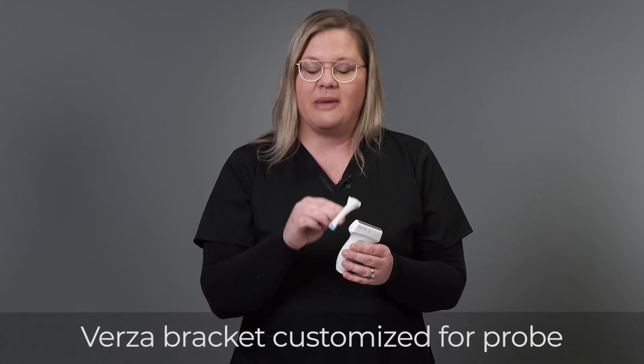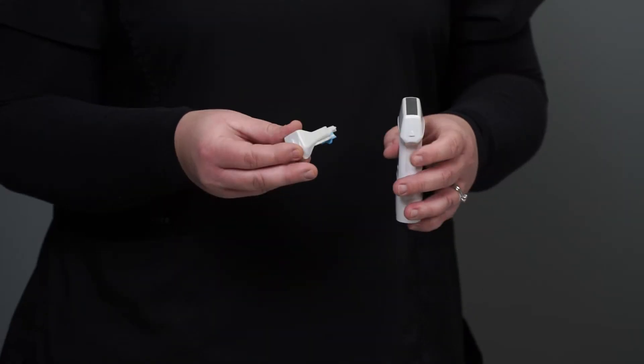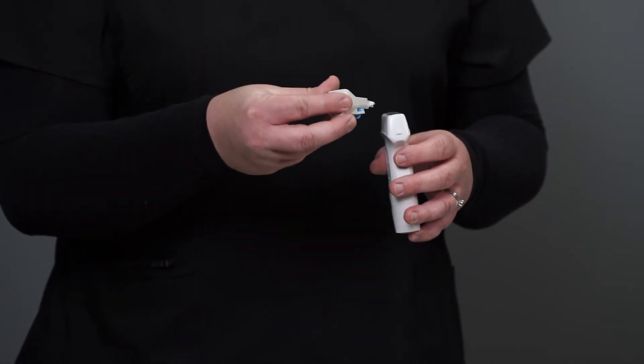The Versa guidance system consists of a probe and a reusable bracket. Remember, your reusable bracket must be compatible with your general-purpose probe when using the system. After identifying the corresponding bracket, you will need to apply the bracket to your probe.